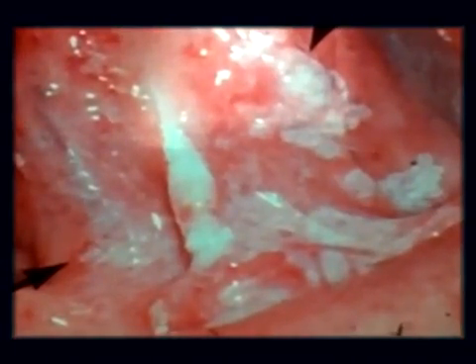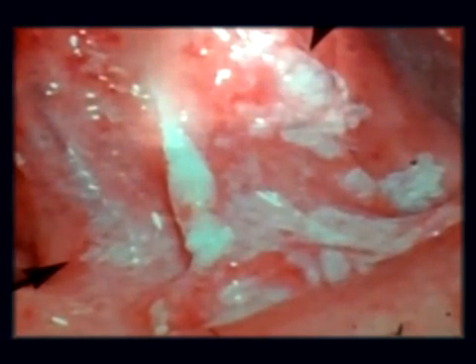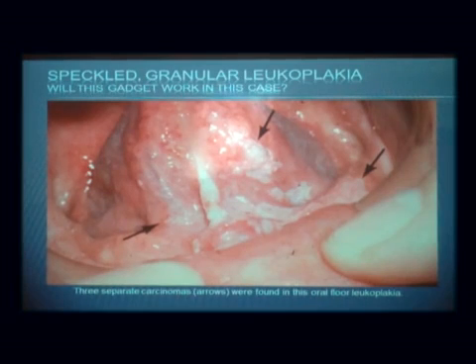But where do you do the biopsy? Would Toluidine blue help to identify some problem in this? I think it would, because we've got areas that are totally or completely surrounded, or red patches, pink patches, and that's where you would go normally to try to do your biopsy. Toluidine blue might find an area that has the cells close to the surface. So I think it would have worked on a lesion like this.